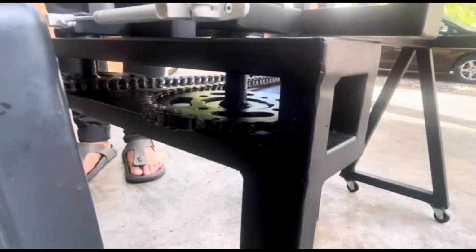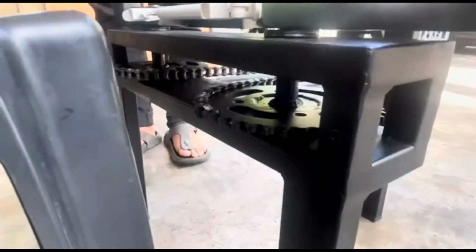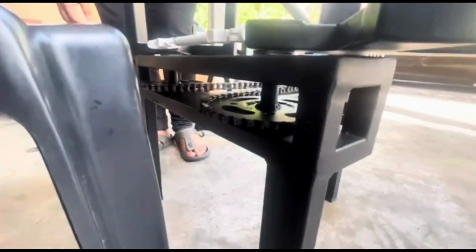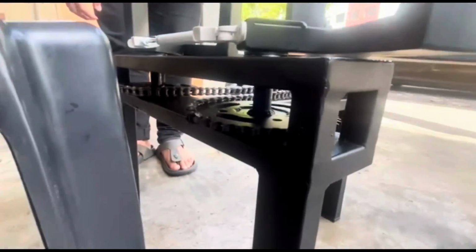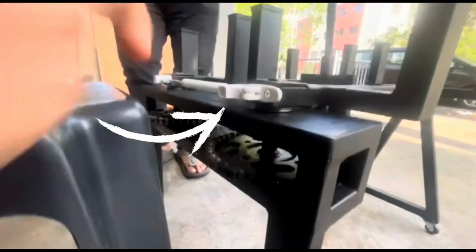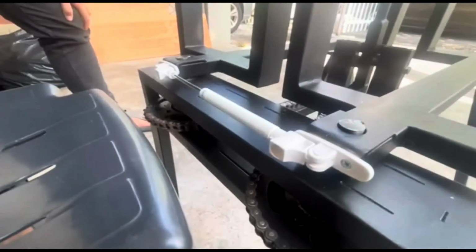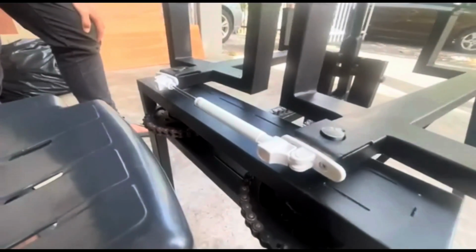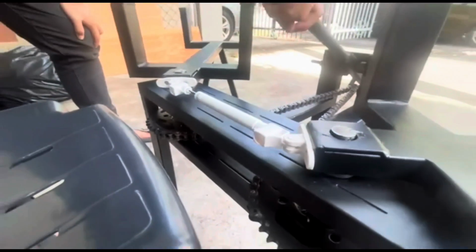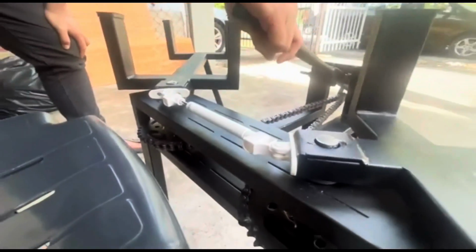The size of the sprocket is 3080, which is the big sprocket, because we want to make the force applied to the handle low. That's why we use a big sprocket. We have used a hydraulic spring damper, which has 100 Newton, to push the leg pad to its original position. So when we pull the handle, the leg pad does not go back to its original position, so we use hydraulics to push it back.